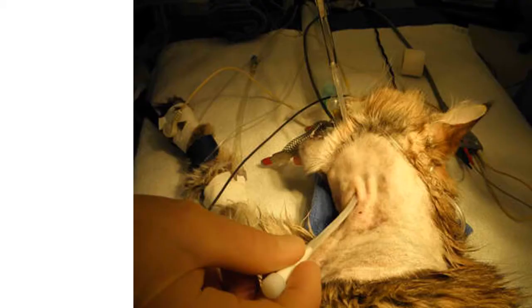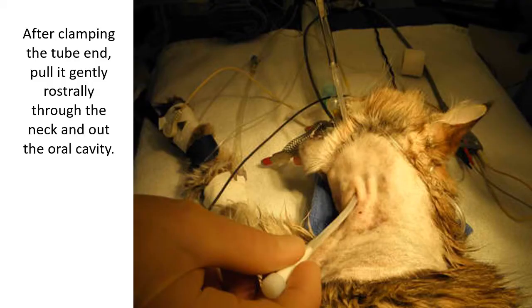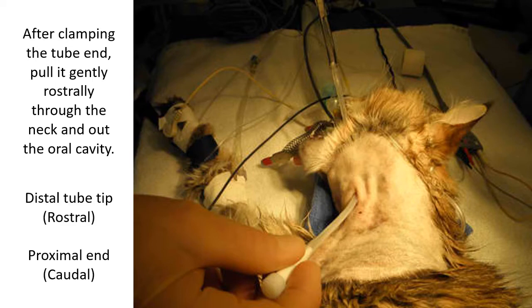After clamping the tube end, pull it gently out of the mouth. Now, the distal tube tip, this one here, that is held by the forceps, is now oriented rostrally, and the proximal end with the cap is oriented caudally. This is like the initial picture that you saw in our title page. So this is a necessary part of esophagostomy tube placement.